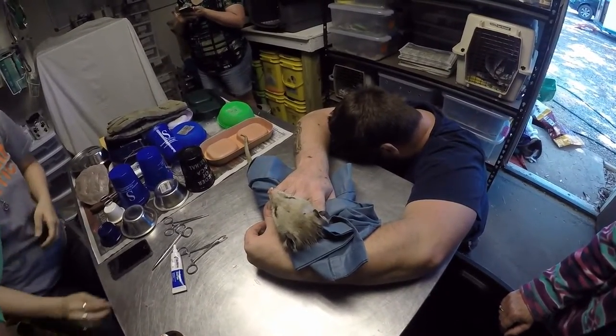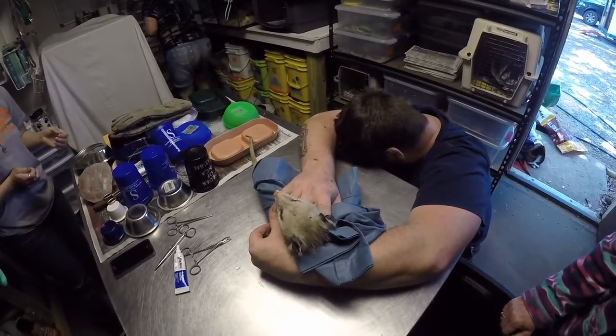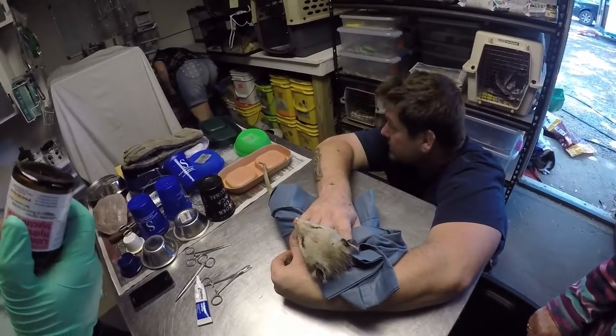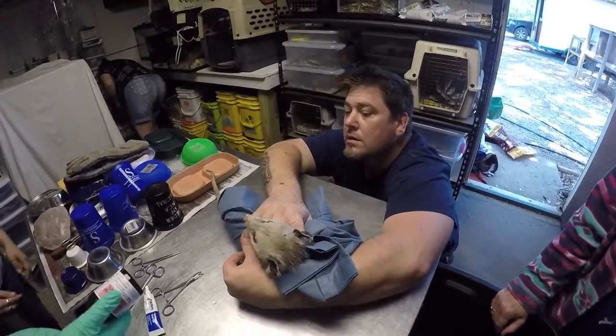Is it smaller than those little chips? 25 maybe? It doesn't hurt as bad. Oh, it's in my eye. Jesus. He's the one we got here.